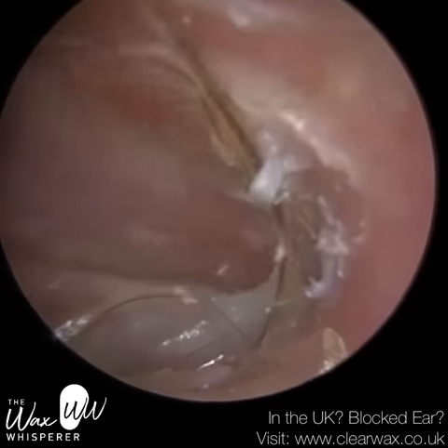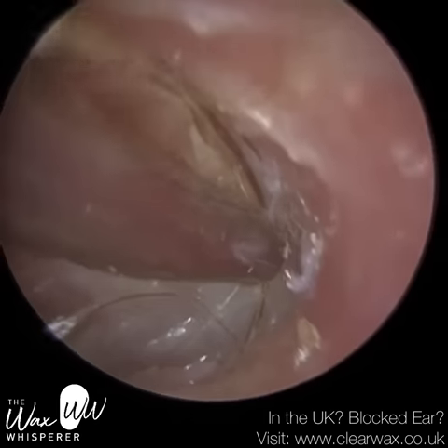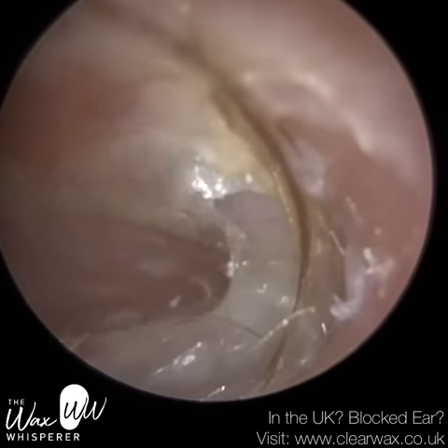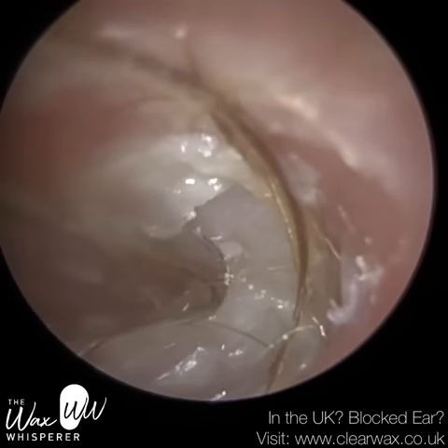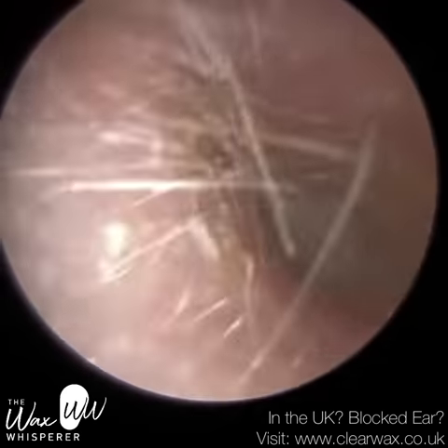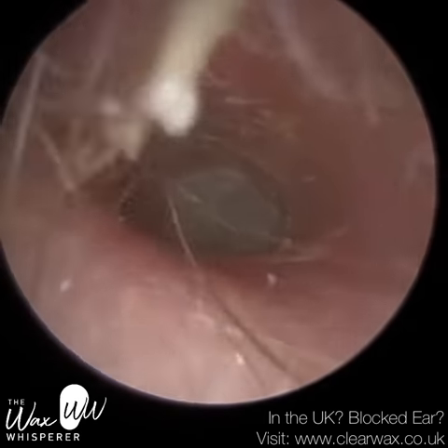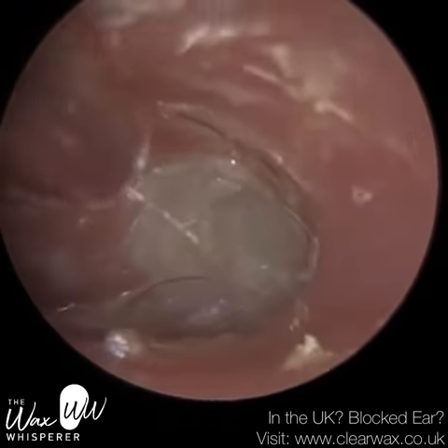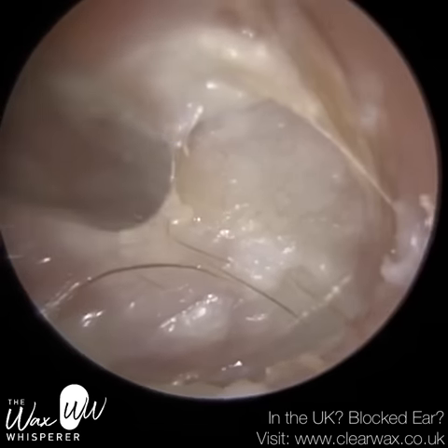As you can see, I'm just using a fine-end suction probe now to delicately remove some of this debris from the back part of the ear canal. You can see there's a big hair strand here. There is some debris, some dead skin on the eardrum as well — it could be macerated skin — so we just want to remove this. We want the drops to come into contact with the surface of the eardrum as well. The outer layer of the eardrum, the more lateral layer towards us, is actually made up of the same skin that lines the inner two-thirds of the ear canal — the bony part — so it's a layer of epidermis, epithelial skin cells. The middle layer is a fibrous tissue layer; that's what gives the eardrum its rigidity and strength. And then the inner membrane of the eardrum — because the eardrum is three layers — the inner membrane is a mucosa layer that lines the middle ear also. The mucosa you can think of as similar to the skin that lines the inside of our nose; it's a secretory type of skin.